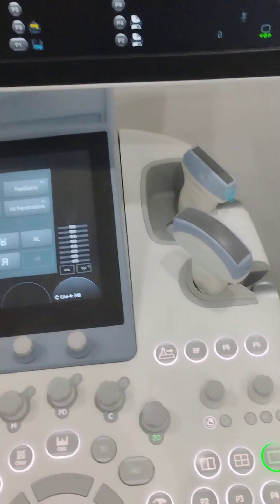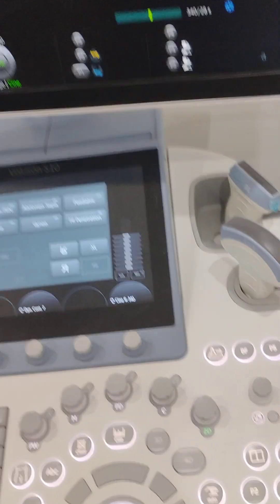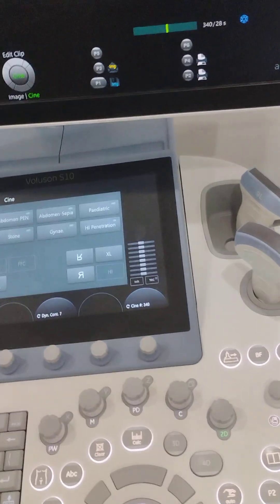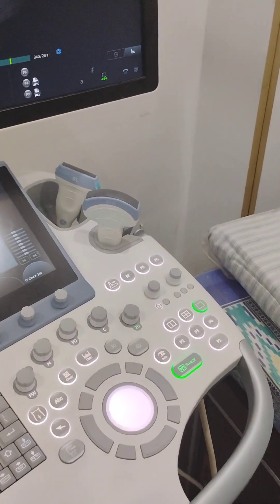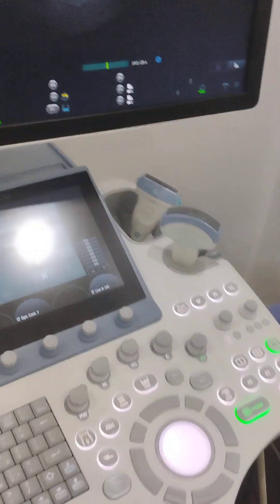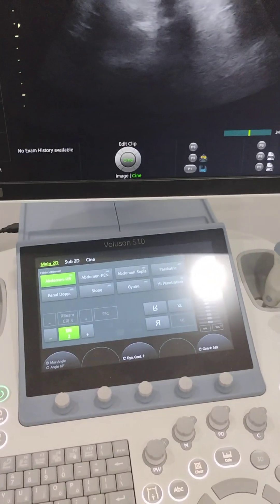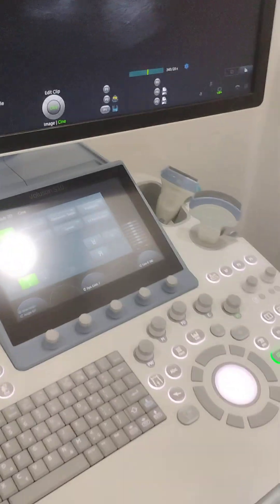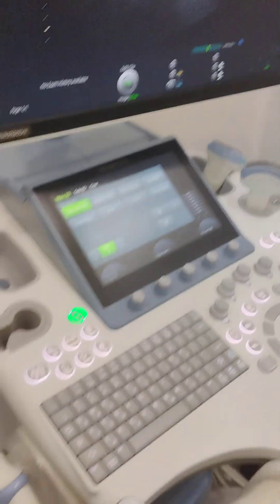These are the probes. Each probe amounts to approximately — I think — 1 to 2 lakhs each. The total cost of the probes sums up to quite a significant figure.